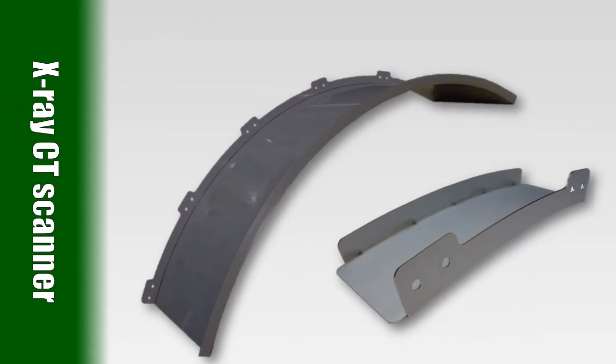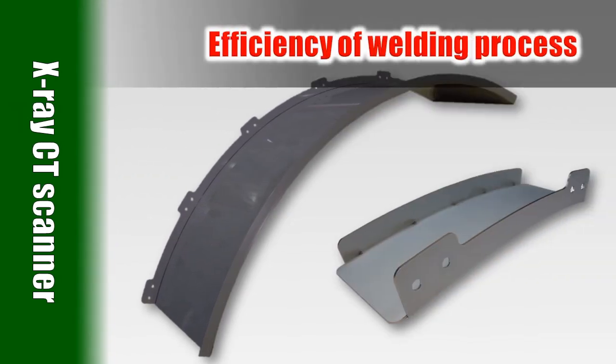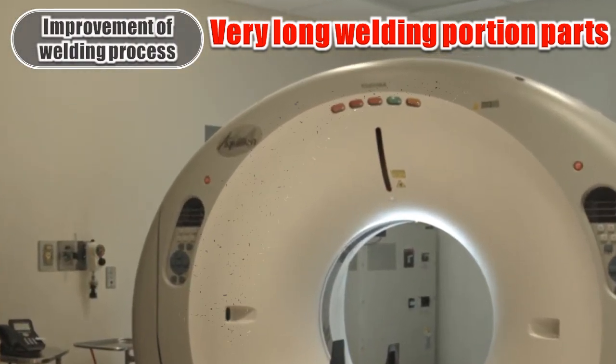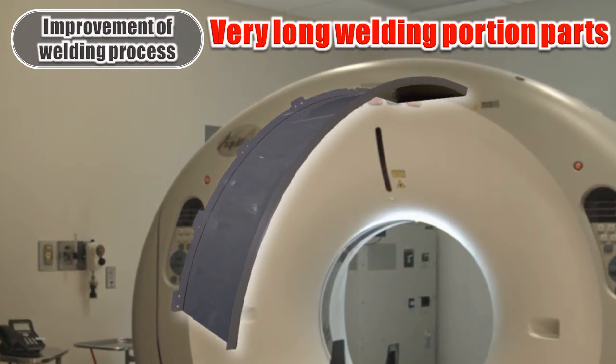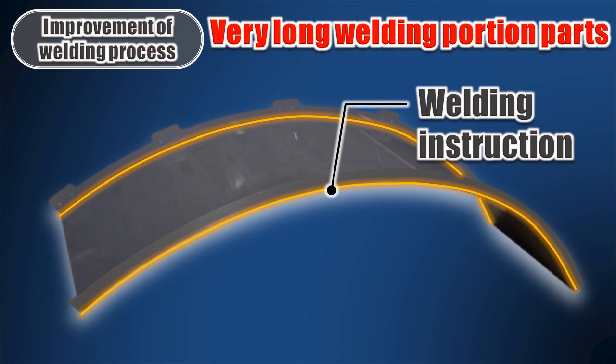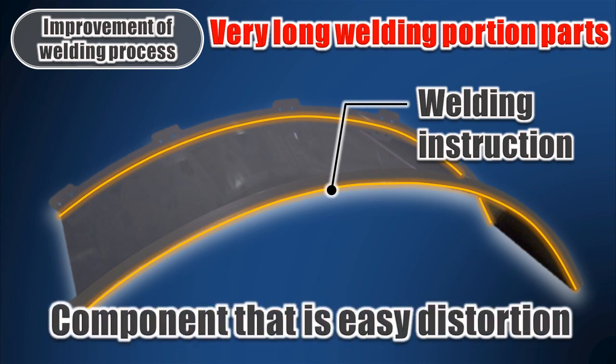Next, we'll take the CT frame as an example to show you how we can improve the efficiency of the welding process. Please take a look at this piece here. The weld portion is very long, and with traditional methods, the heat will likely deform the material, so it requires higher welding skills.